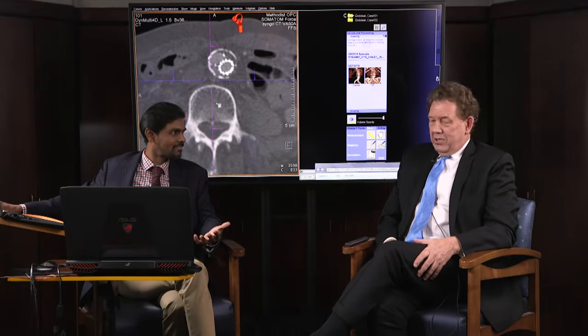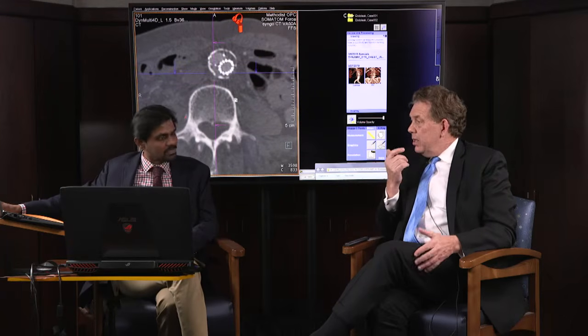Conceptually, if you take the ribs from the scan we've just done, no dye, take the ribs from the CTA that was done, and we align the bones in 3 dimensions, in theory, the blood vessels should be aligned. But here we are fortunate enough to have a very great fiducial, which is the stent graft. So we're going to fuse the stent graft to stent graft. Now, the other way that we've done fusion is with, I will say that our patients all have bones in their blood vessels.